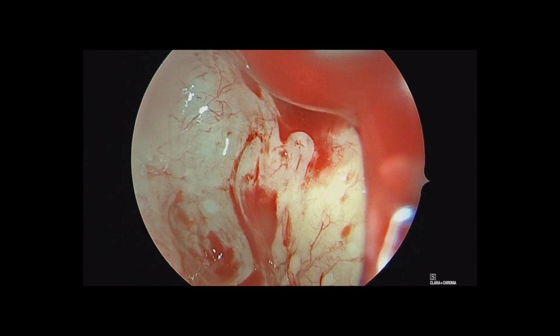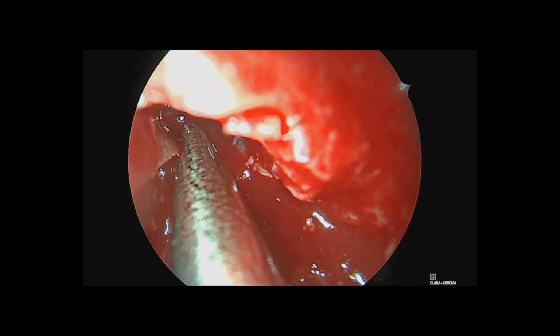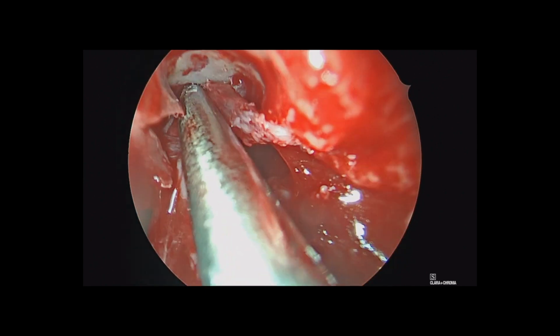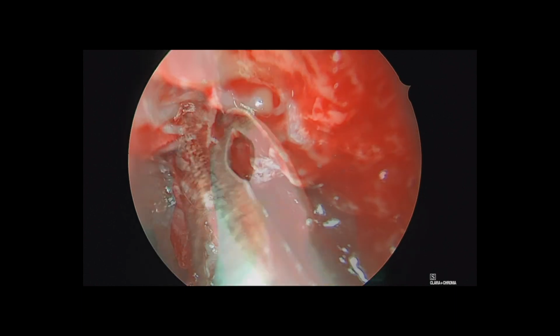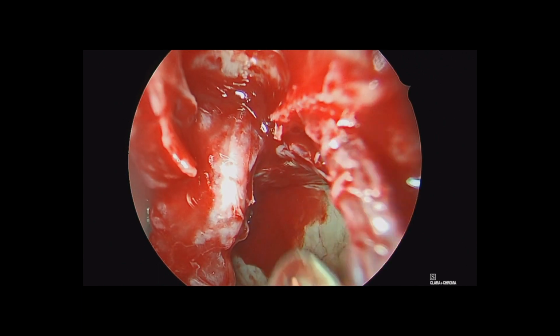And here we are endoscopically through the face of the maxillary sinus, dissecting out the infraorbital nerve along the orbital floor, ensuring that we are resecting the nerve as well as the associated periosteum and soft tissue of the infraorbital canal. We'll go ahead and mobilize the mucosa around it and bring that with us as well.